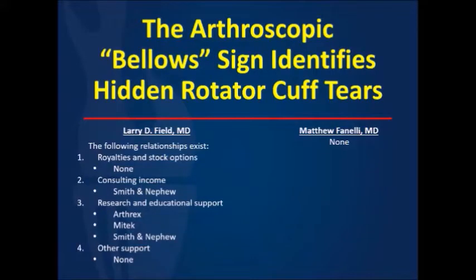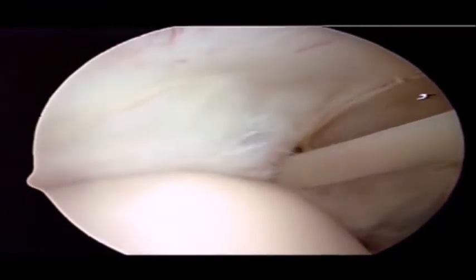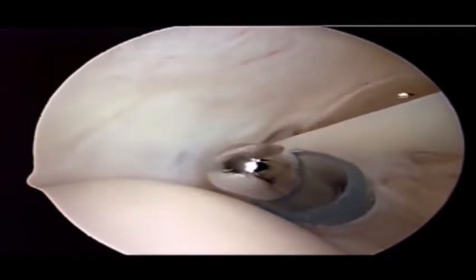The arthroscopic Bellows sign identifies hidden rotator cuff tears. In this left shoulder in the beach chair position, we can see with limited motion of the glenohumeral joint, fluid extravasating in and out of a rotator cuff tendon defect.